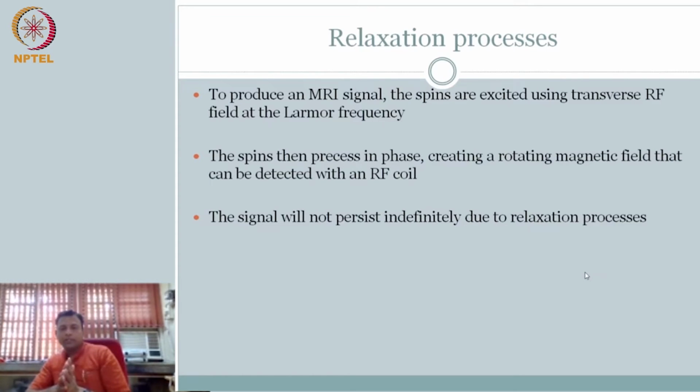So naturally, we need to talk about how it is losing signal strength. In the relaxation process, how all can it lose signal strength? One is dephasing. The moment it starts to dephase, you have a lack of signal coherence, and therefore a lack of signal. The signal is dying down.